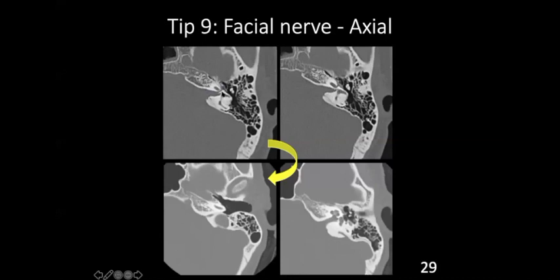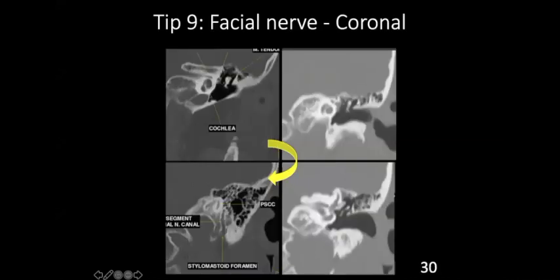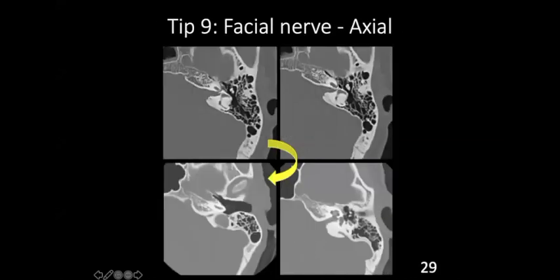At a lower cut, the ice cone appearance just starts to appear — this is the upper part of the ice cone. Here you see the geniculate ganglion. In a properly done axial section, the facial nerve will be seen running backwards, showing the complete course. This is the horizontal part running backwards — you see it turning from the geniculate ganglion going posteriorly in a clockwise direction.